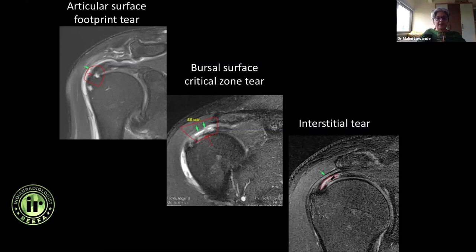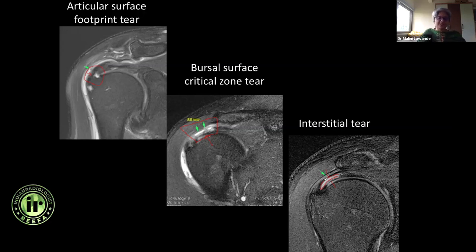Sometimes you can have interstitial tears where the tear is entirely within the substance of the tendon — articular and bursal surface fibers are intact. The surgeon cannot see it arthroscopically, and an arthrogram would not show contrast going in there. Again, state how much thickness is involved — this is more than 50 percent thickness of the tendon. Most partial thickness tears are managed conservatively to begin with, but when more than 50 percent thickness and the patient is not responding, surgical planning may follow.